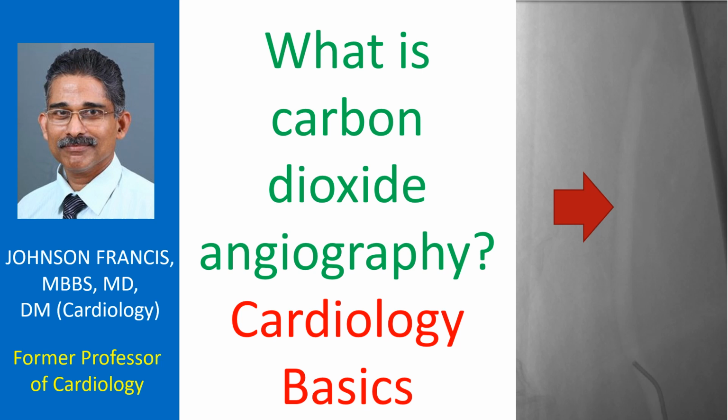Carbon dioxide angiography is done by using carbon dioxide injection into the blood vessel. Usually, iodine-containing radiocontrast dyes are injected into the blood vessels and continuous X-ray imaging done to obtain angiograms. Contrast material is needed to visualize the blood vessels separately from the other body tissue.